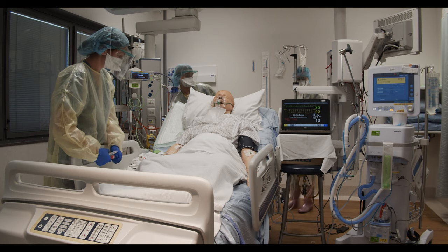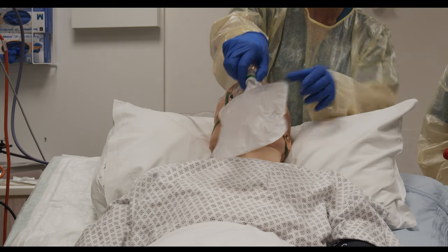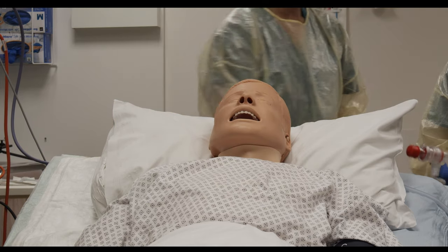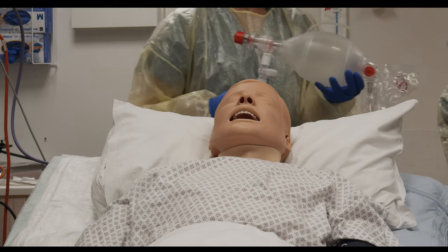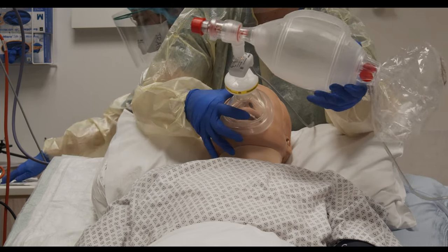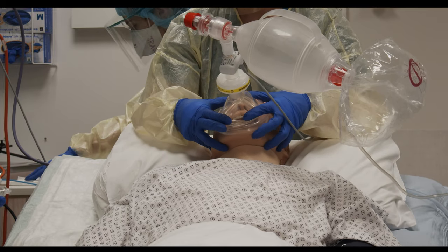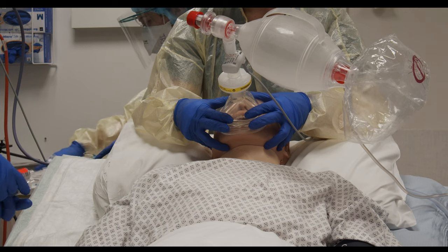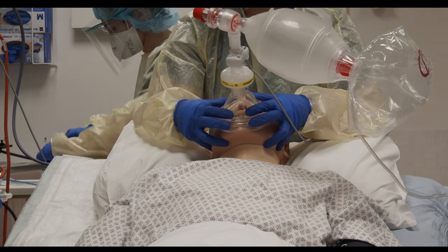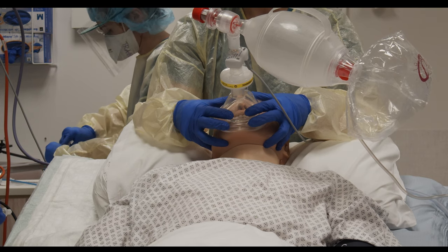At this stage, the intubator will turn off the oxygen running through the non-rebreather prior to removing the mask, and the airway assistant can turn on the oxygen flow attached to the ambu bag to 15 litres per minute. The ambu bag will then be fitted to the patient's face with a two-handed technique, counselling the patient through this and reassuring them of what you're doing. We would advocate for starting with 15 litres of flow and however much PEEP is required to achieve the best possible oxygenation whilst minimising the leak from the mask.